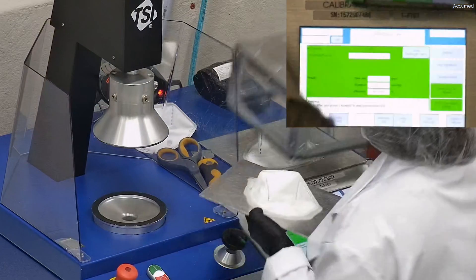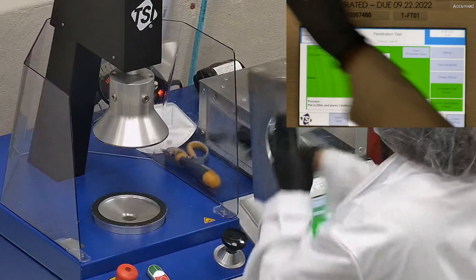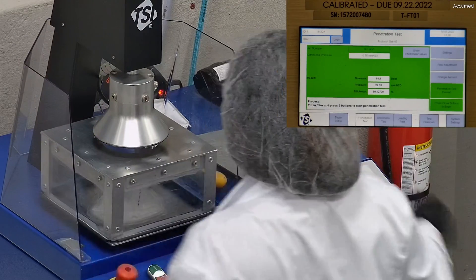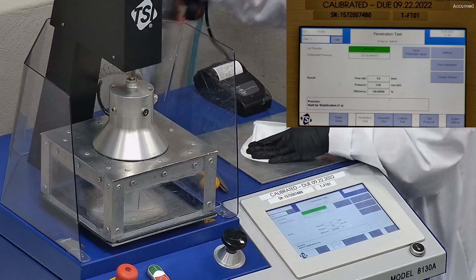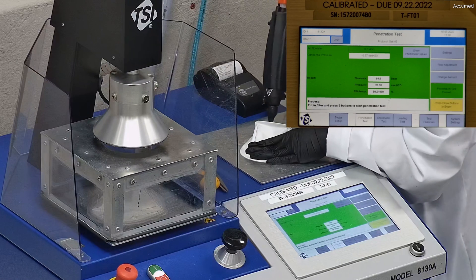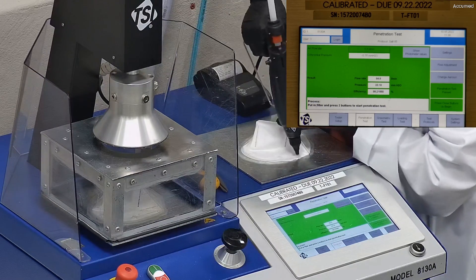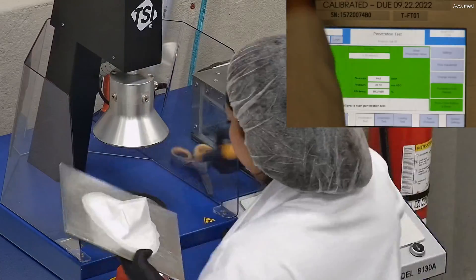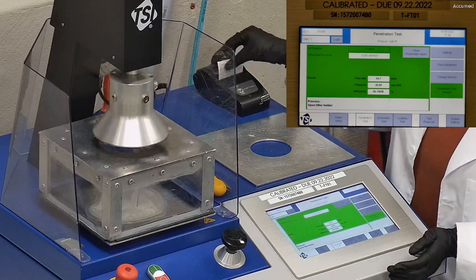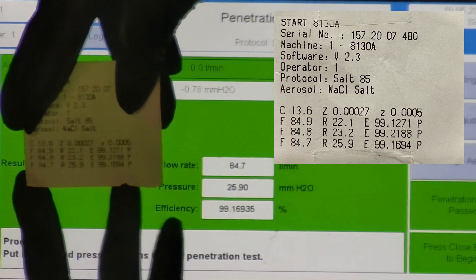The first sample tested at 99.12% filtration efficiency with a pressure drop of 22.1. This is a bit high, but it's still within the NIOSH requirements. The second sample had a filtration percent of 99.21 with a pressure drop of 23.2. The last sample filtration percentage was 99.16 with a pressure drop of 25.9. We were having some issues with the camera focus, so the results have been added on the side of the screen.